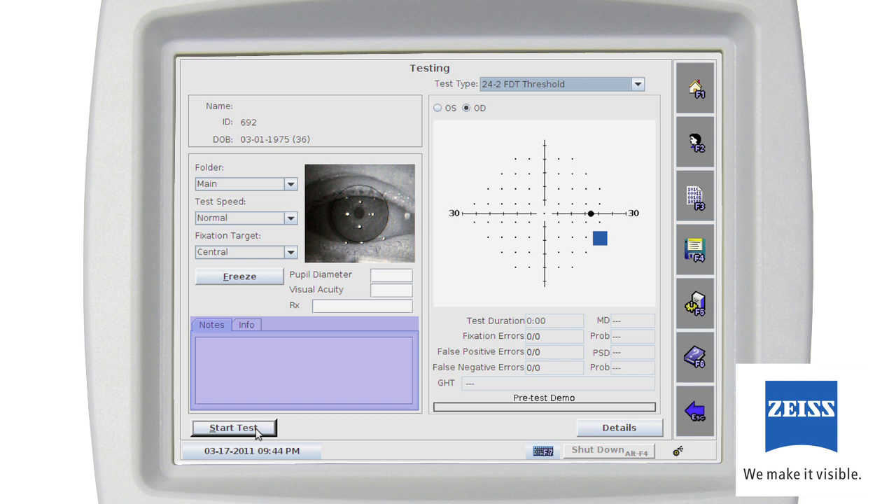By selecting the info tab, you may enter additional test information at any time including diagnostic code, procedure code, pupil diameter, visual acuity, IOP, horizontal and vertical cup to disc ratio, and patient RX. A typical 24 to 2 full threshold test will take about 5 minutes. During that time, you should watch your patient's alignment and test responses on the testing screen. A Y is shown at the tested location when the patient responds, and N is shown when there's no patient response. At the conclusion of the right eye test, the unit will beep and the Humphrey Matrix will automatically store the test in your patient's record.